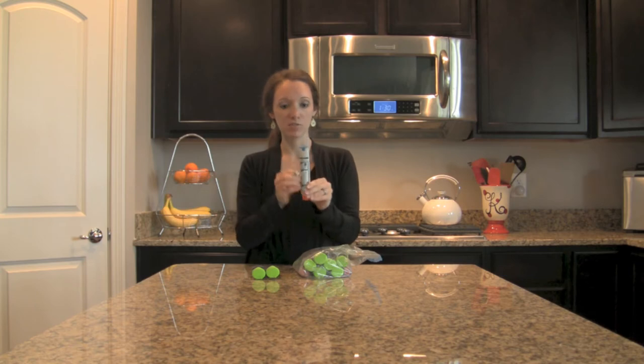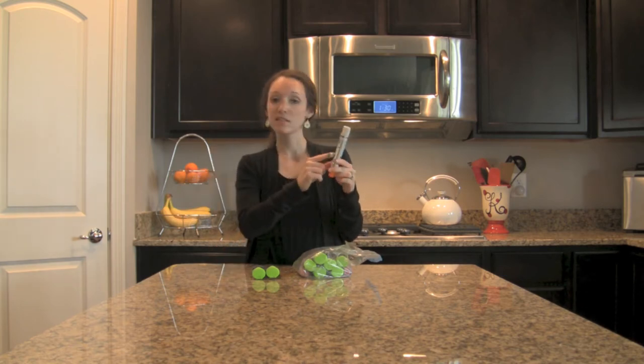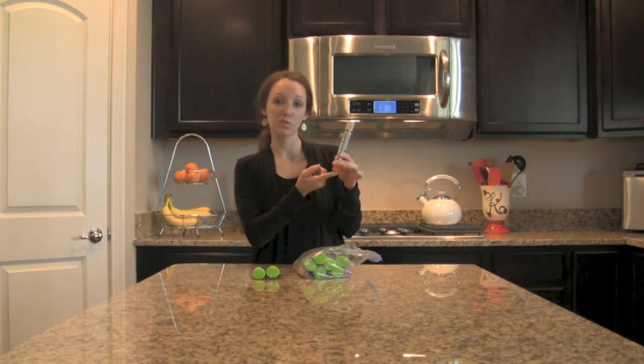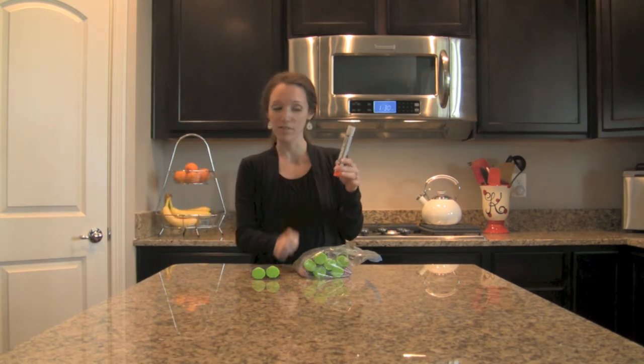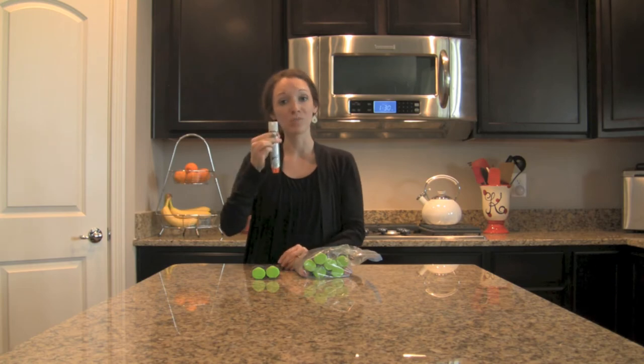It's very easy to use. You're always going to remove the blue cap, then swing and firmly push the orange tip — this is where the needle comes out, so do not put your finger there. Hold it with a fist so you can get a good grip on it, and press it in until you hear the click, then hold for 10 seconds.